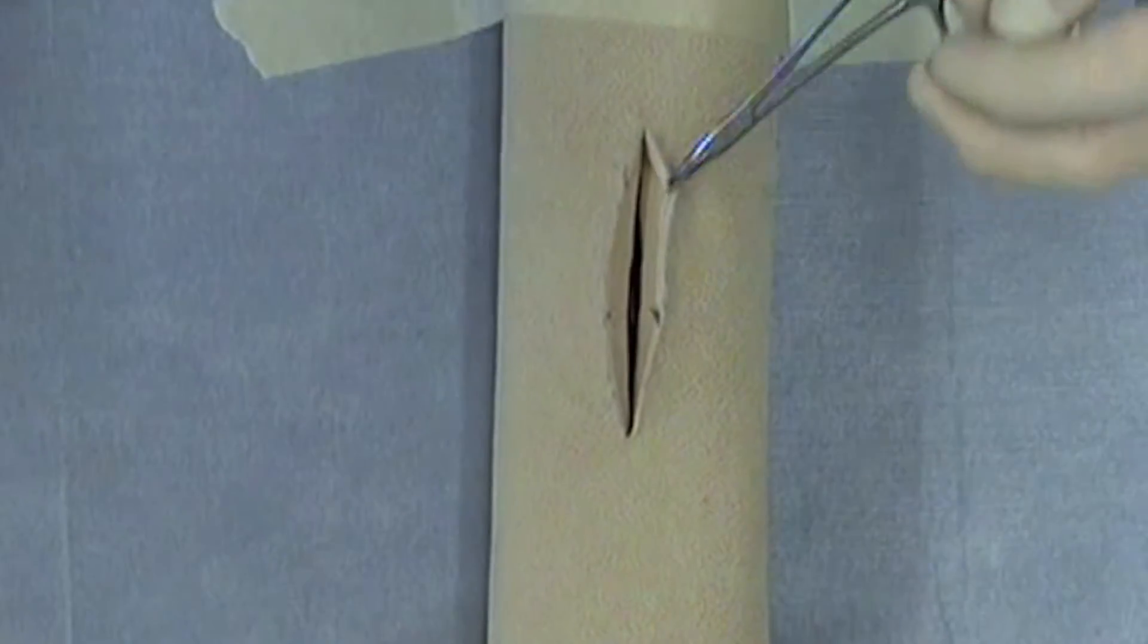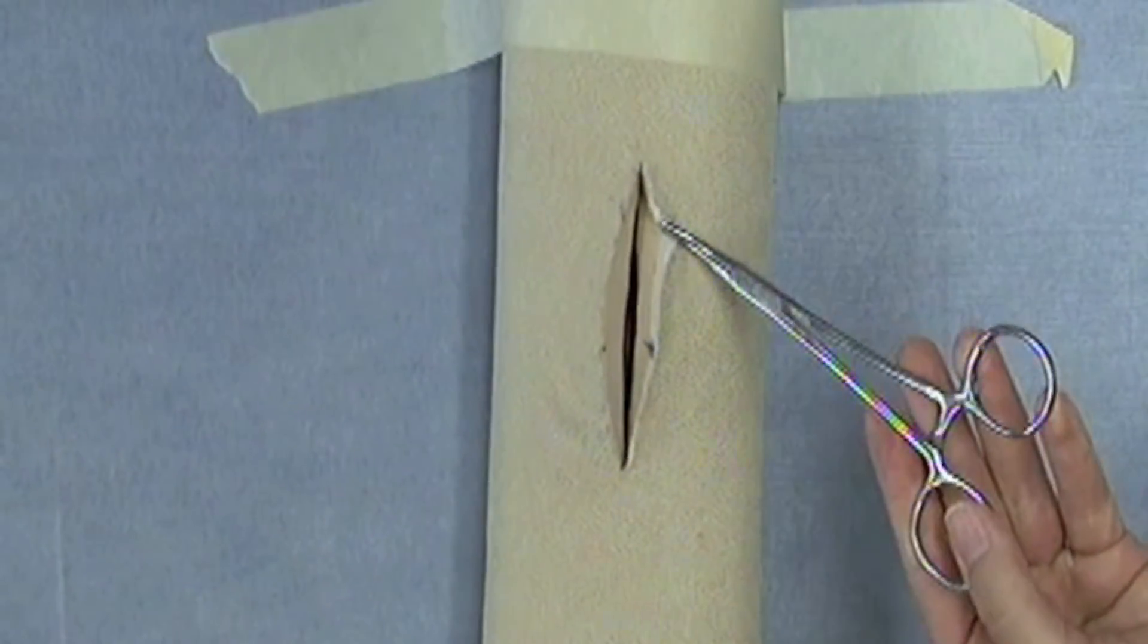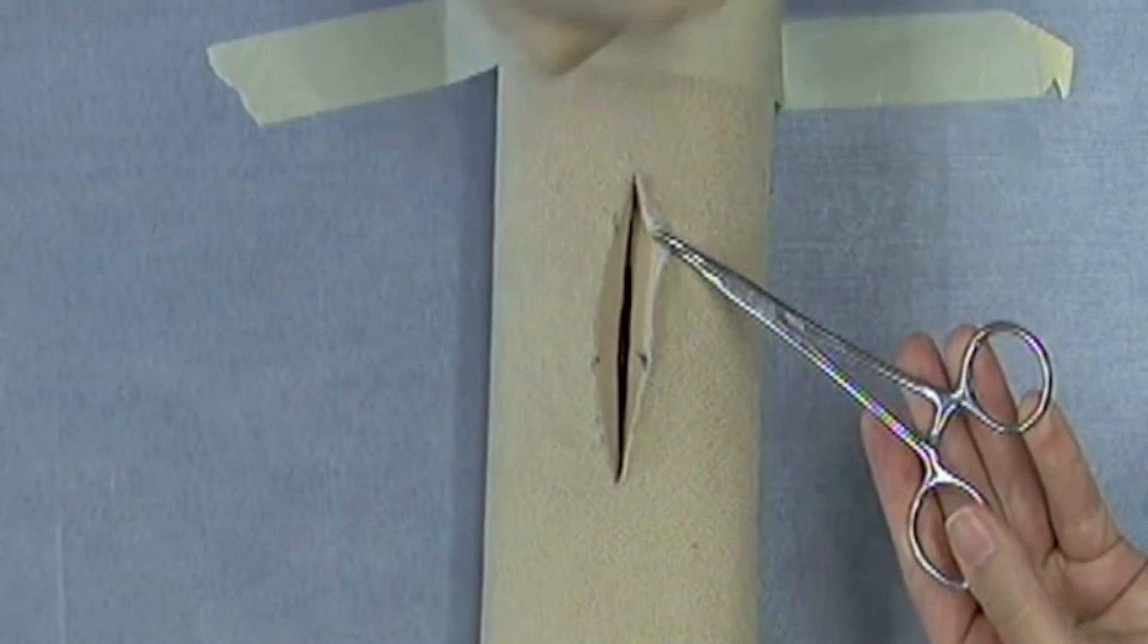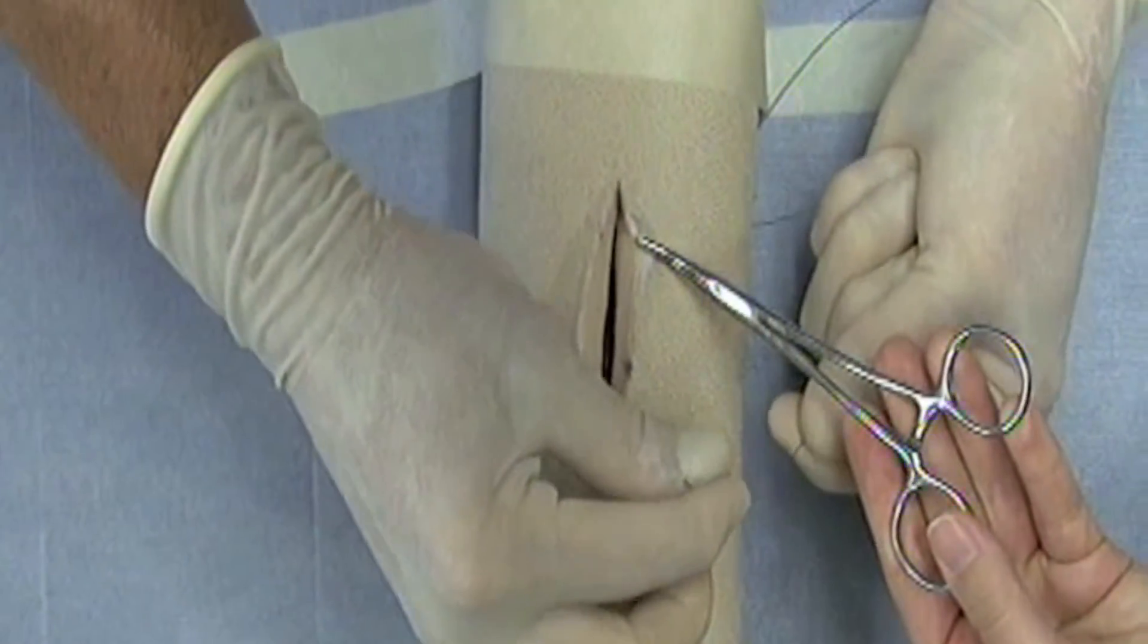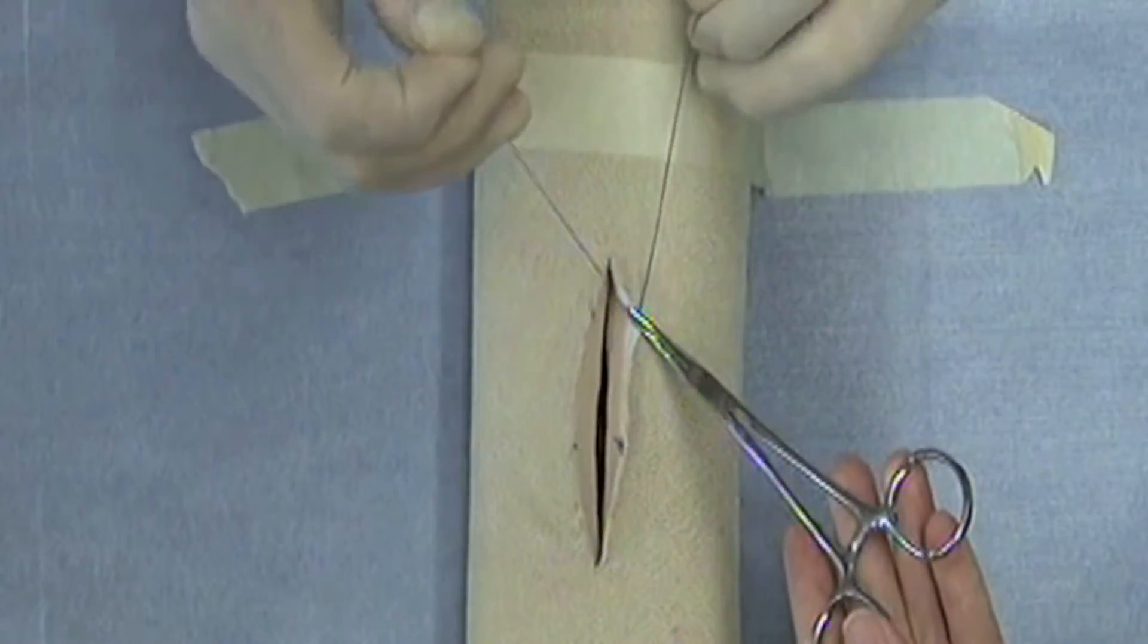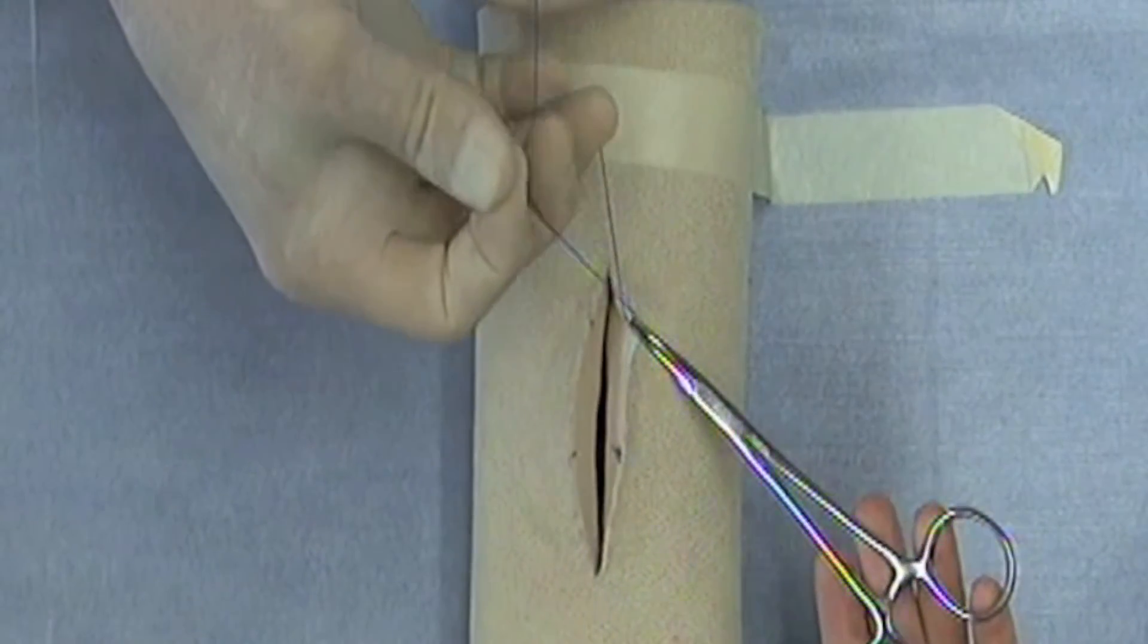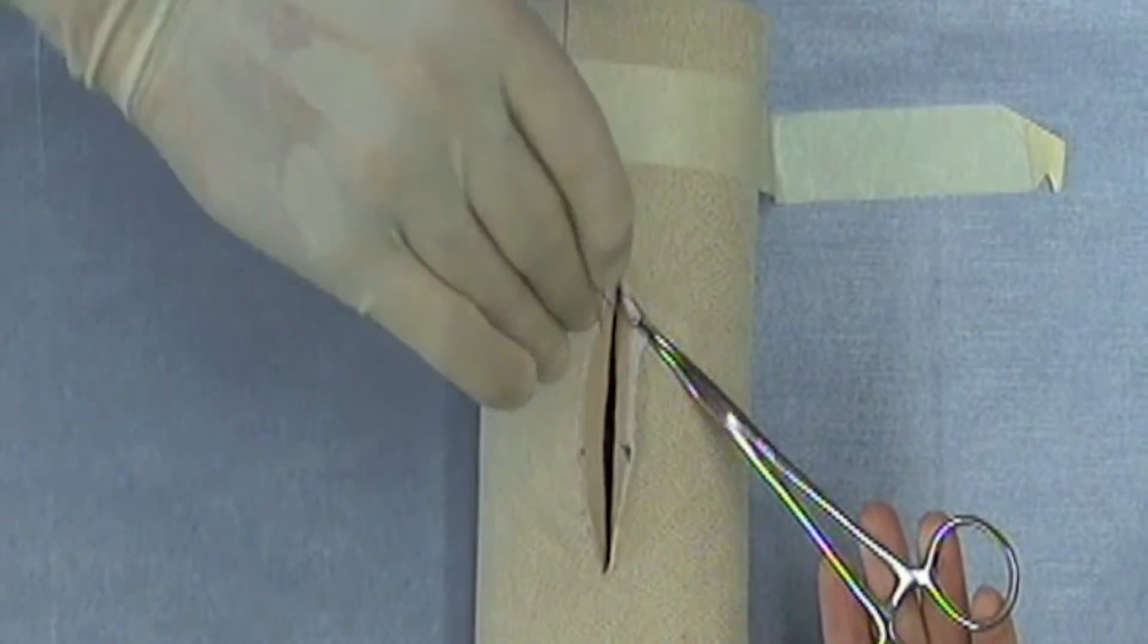For this hemostatic forceps and vessel, I will demonstrate a right-hand one-hand tie. Notice the difference right away is that I'm using the short end of the suture material now in my right hand. The tips of the instrument are up, meaning that I can clearly see the tips being the surgeon. I'm going to complete a one-handed tie.